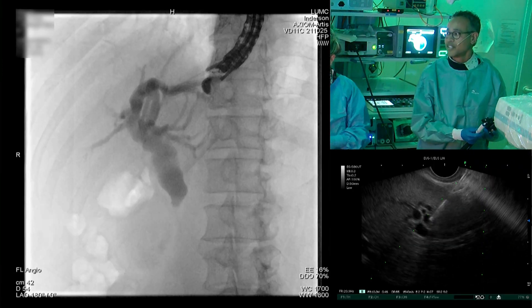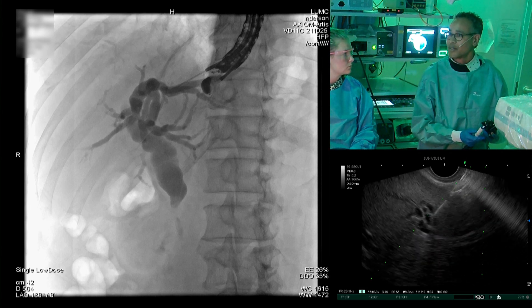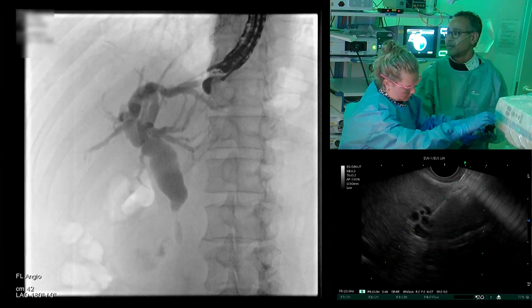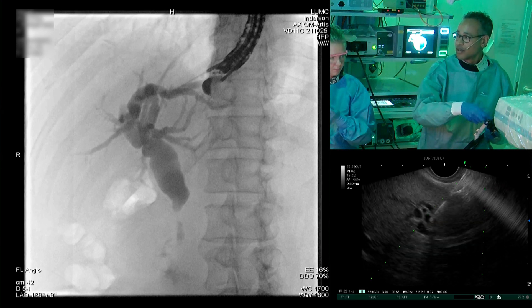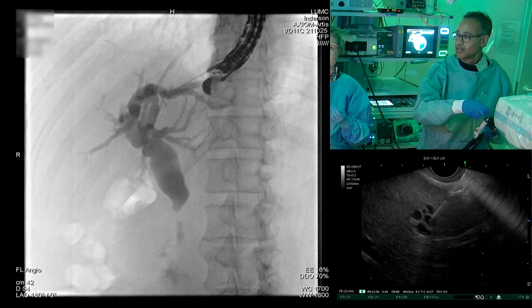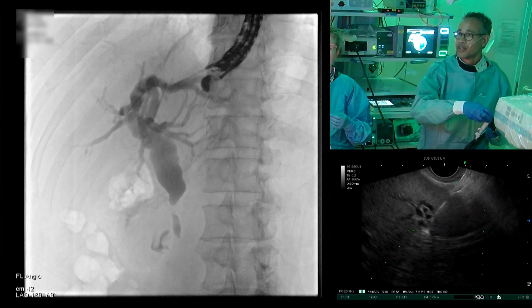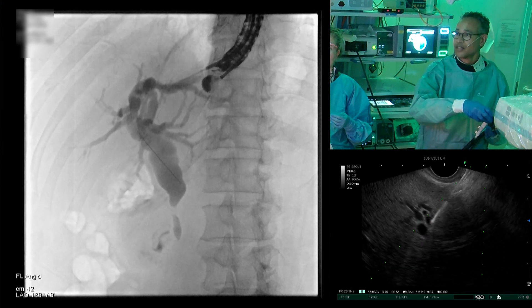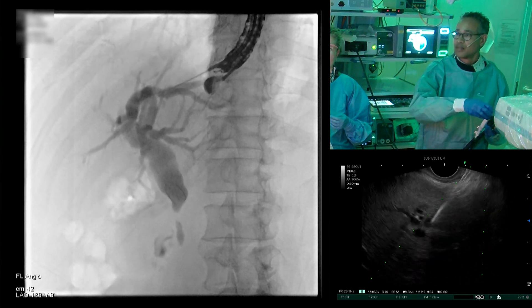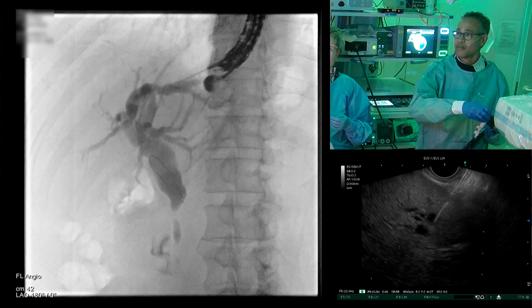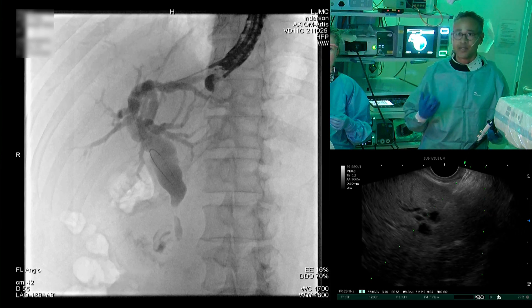Here you see the fluoroscopy image with the intrahepatic biliary ducts filled and the common bile duct also filled. You see tapering of the distal bile ducts. Next up is the guidewire — I'm using a regular ERCP straight 0.035 guidewire. The tip is hydrophilic, which I need for it to follow through and hopefully go down to the common bile duct. And here you see that it does. It will probably not pass through the duodenum, which is not necessary at this stage, but we have access to the central biliary system.